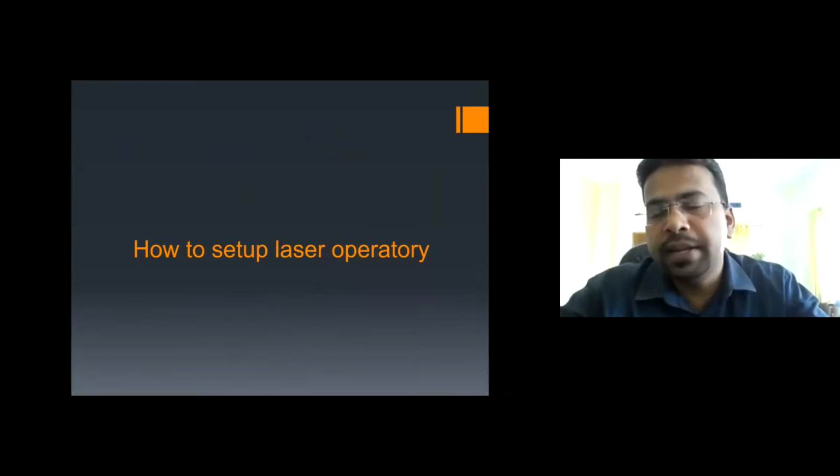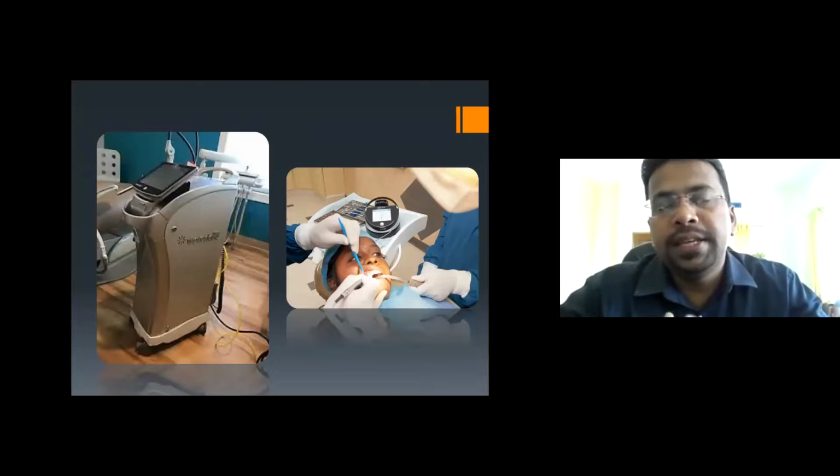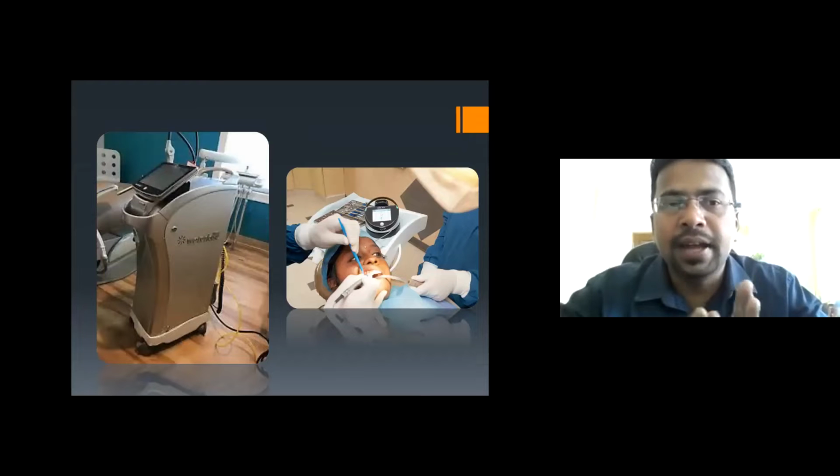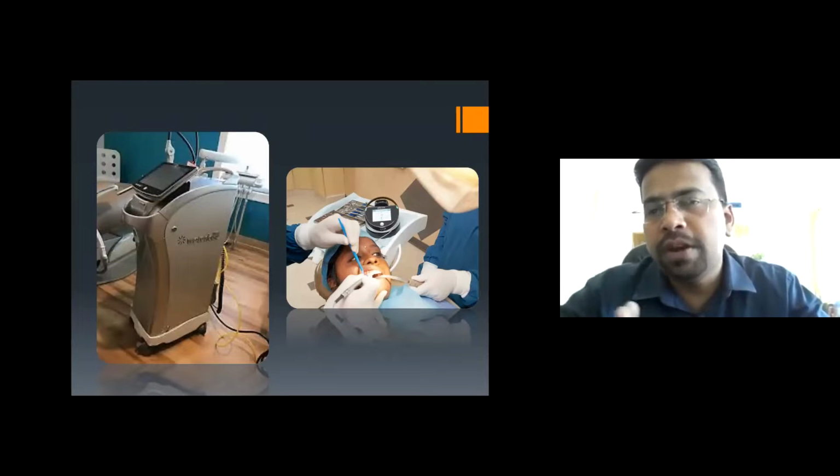Now, how to set up a laser operatory? See, the laser which is present on screen on the left is a hard tissue laser, and the one on the right side is a soft tissue laser.